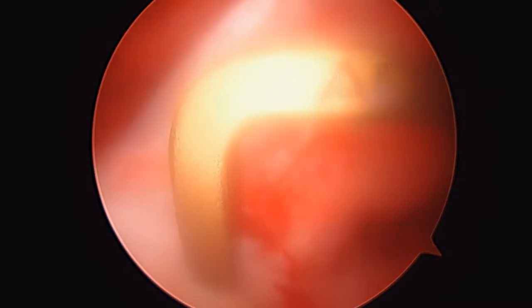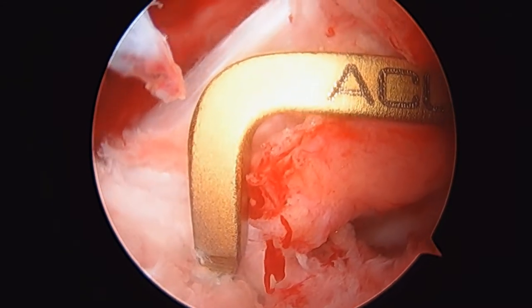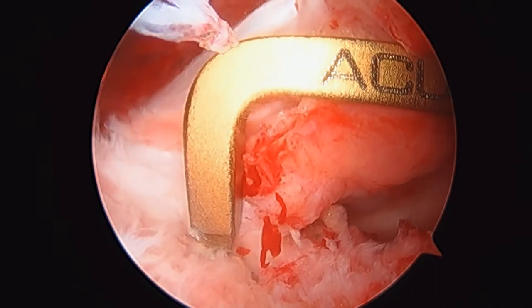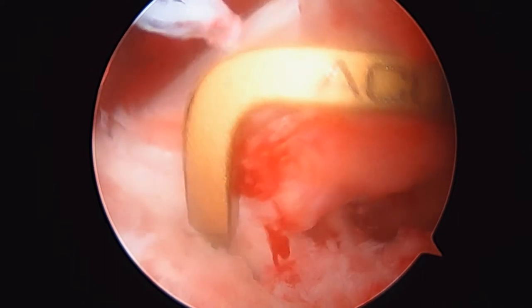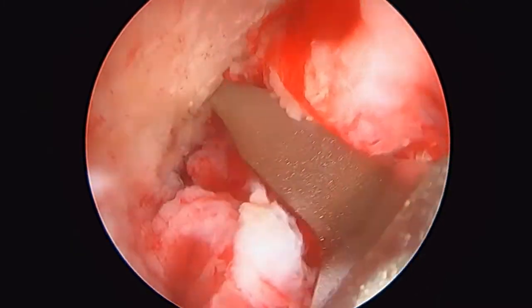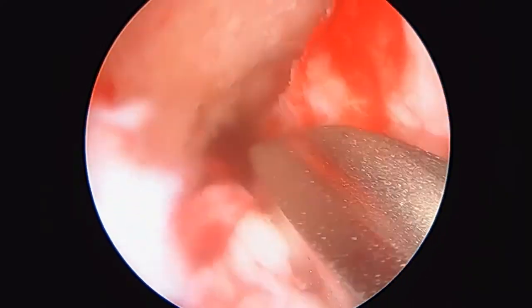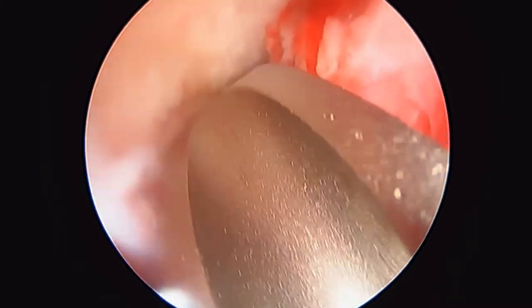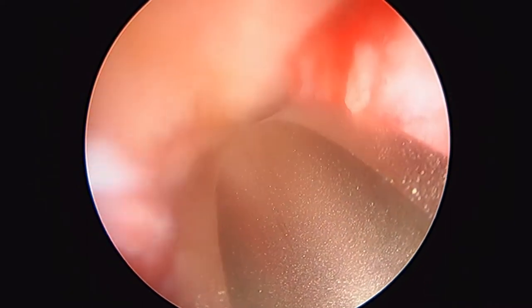This guide is what we use to start drilling some tunnels in the bone. What you'll see here next is a guide wire coming up basically right at the point of that gold guide. We're using a specific guide that gets us way in the back of the knee to place our next guide wire. This particular placement is about six millimeters from the back edge. I just wanted to give you an idea of what the guide looks like.